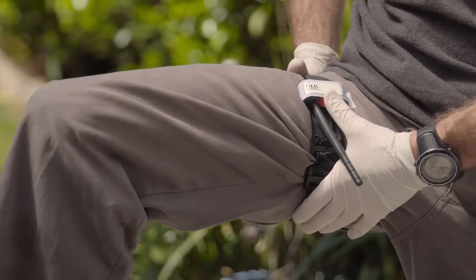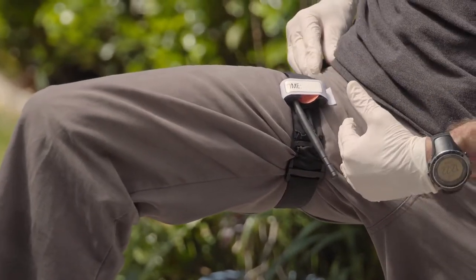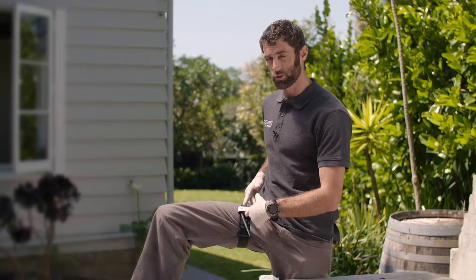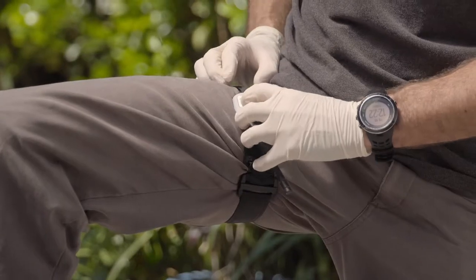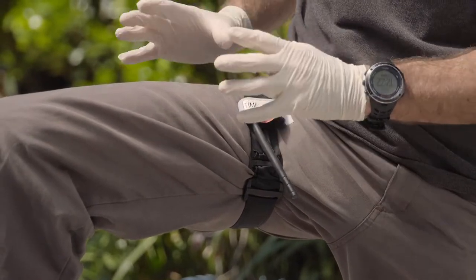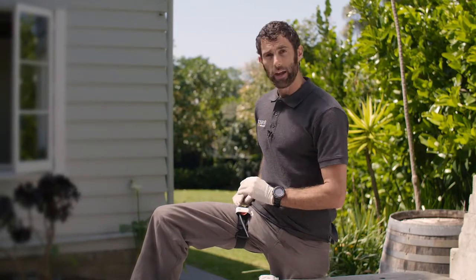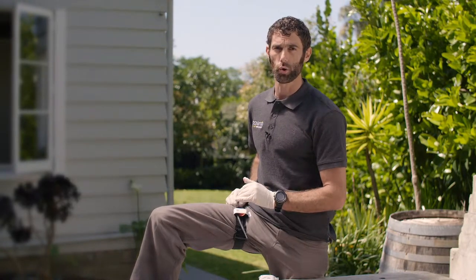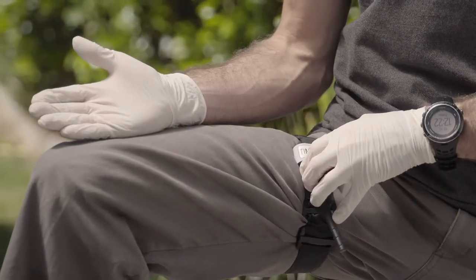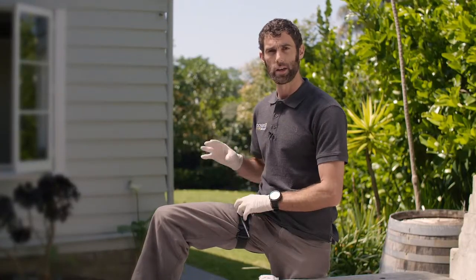If the tourniquet is not tight enough or is not working, expect to have to put another tourniquet on above it, and even a third. A lot of casualties come in with two or three tourniquets before they get into the emergency department. This can stay on for as long as you need to stop the bleed — the bleed is going to kill the person, not the tourniquet. If you're a long way from help, you can use a satellite phone to talk to an expert about re-perfusing or getting blood back into that limb. But for now, the most important thing is to leave the tourniquet on and stop the bleed.